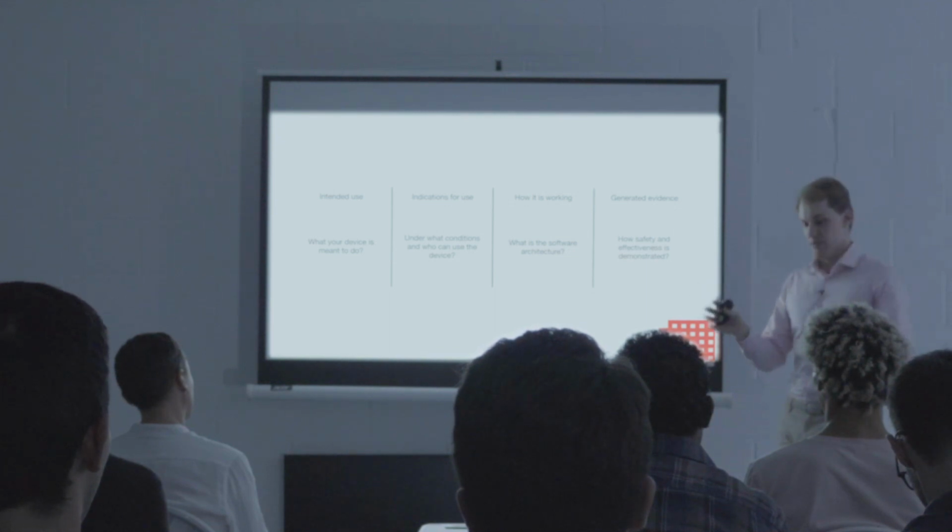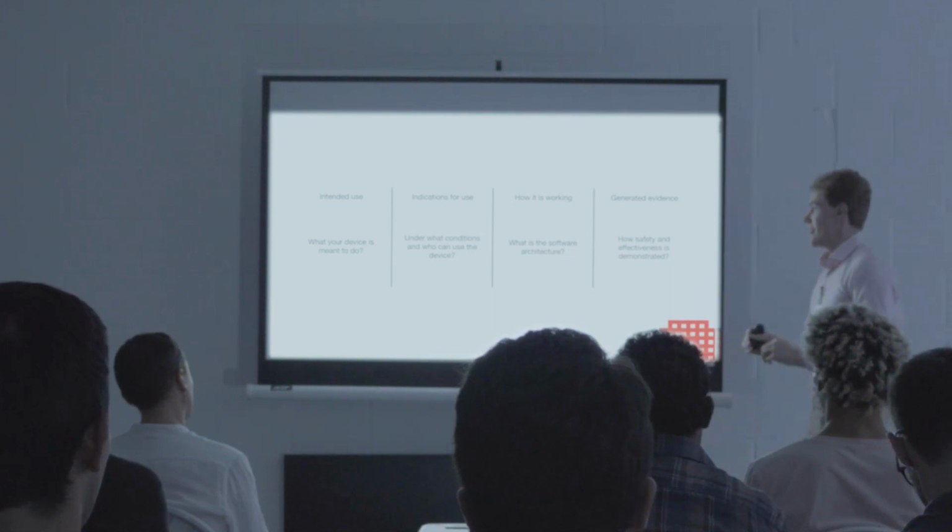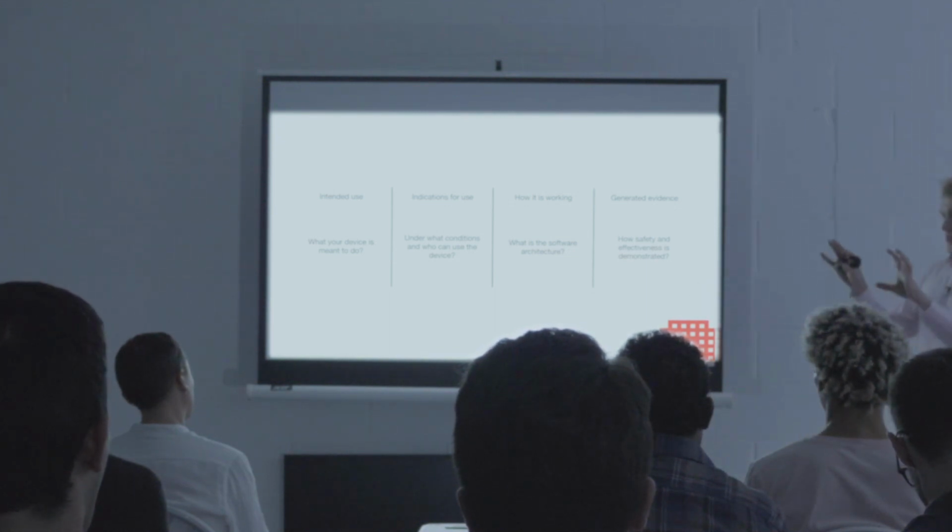And there is a technical part of this. When you build software, you need to produce a set of documentation, for example, software architecture: how your device is built, what your components are, and how it generally works. So you want to show that you laid out your device logically, and there are no potential places for it to fail.